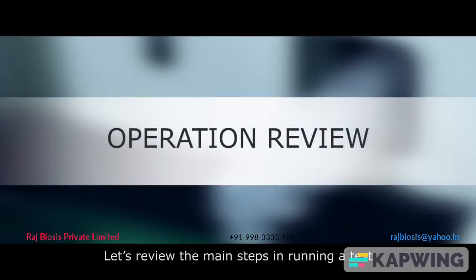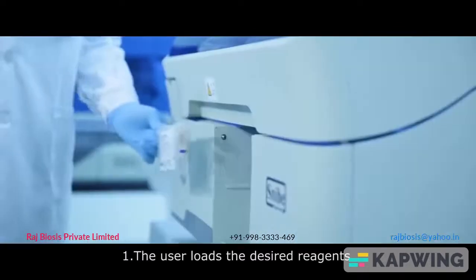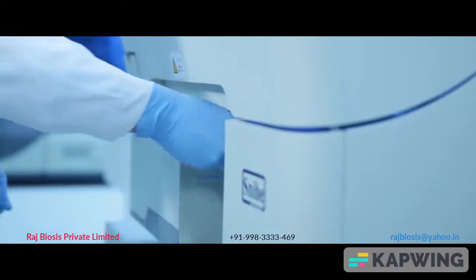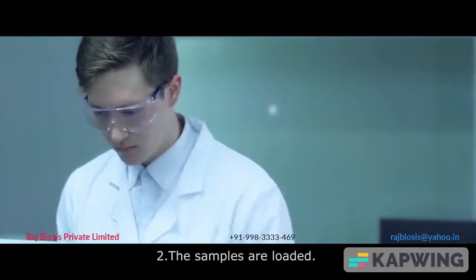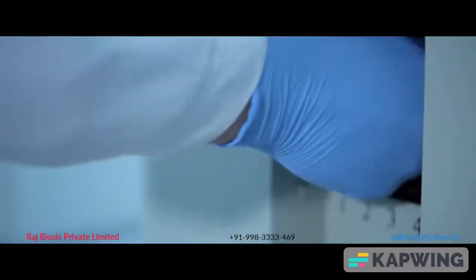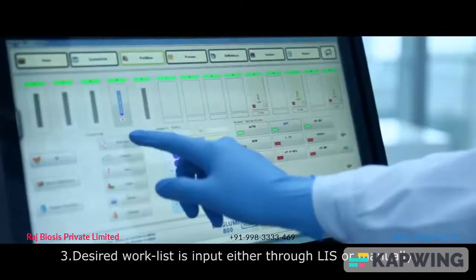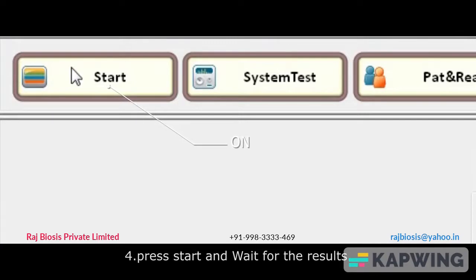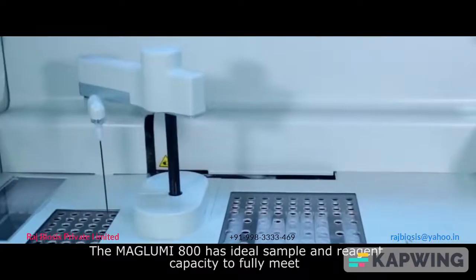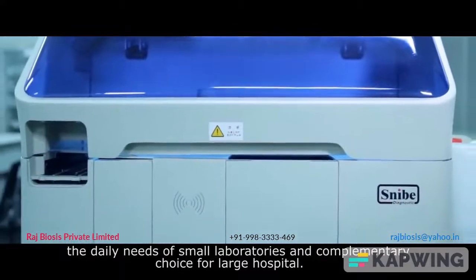Let's review the main steps in running a test: 1. The user loads the desired reagents. 2. The samples are loaded. 3. The desired worklist is input either through LIS or manually. 4. Press Start and wait for the results. The Maglubi 800 has ideal sample and reagent capacity to fully meet the daily needs of small laboratories and is a complementary choice for large hospitals.